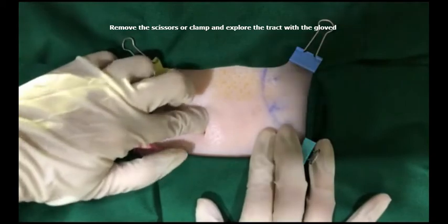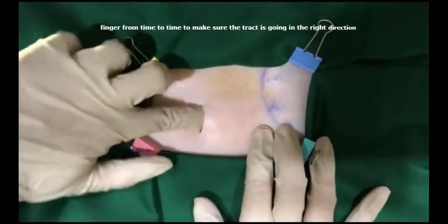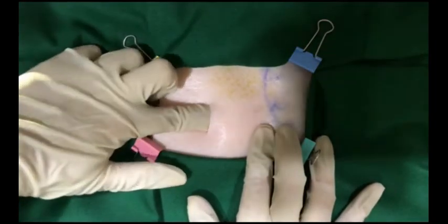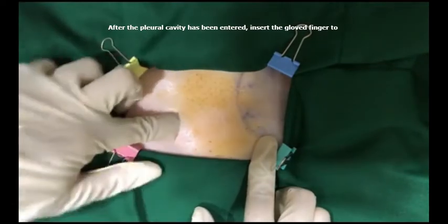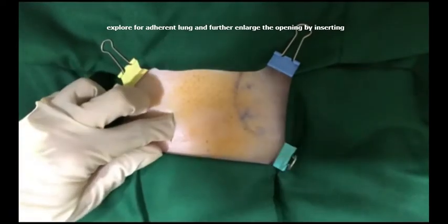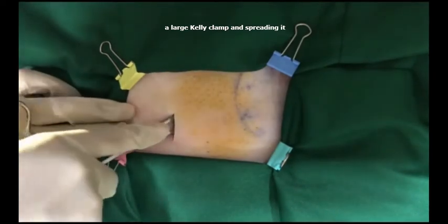Remove the scissors or clamp and explore the track with a gloved finger from time to time to make sure the track is going in the right direction. After the pleural cavity has been entered, insert the gloved finger to explore for adherent lung and further enlarge the opening by inserting a large Kelly clamp and spreading it.